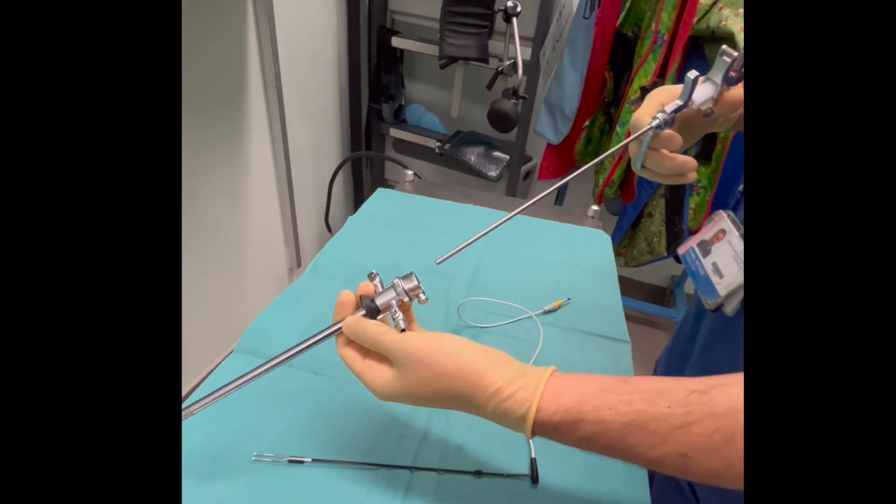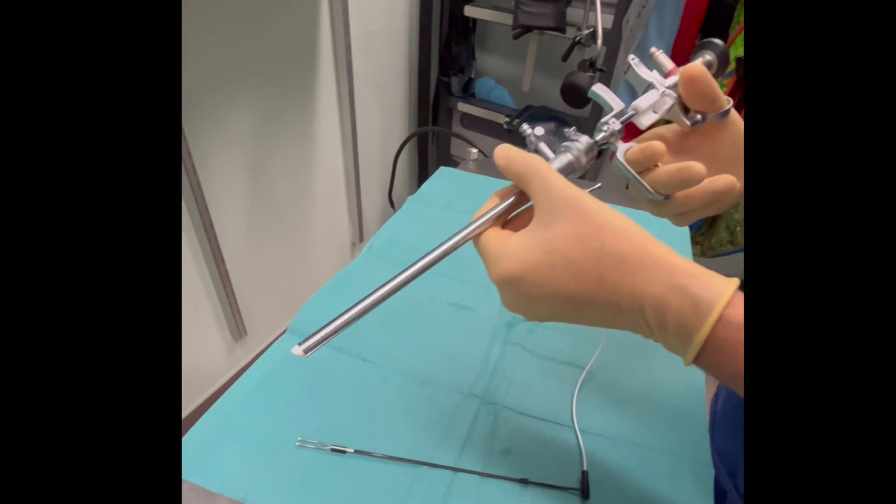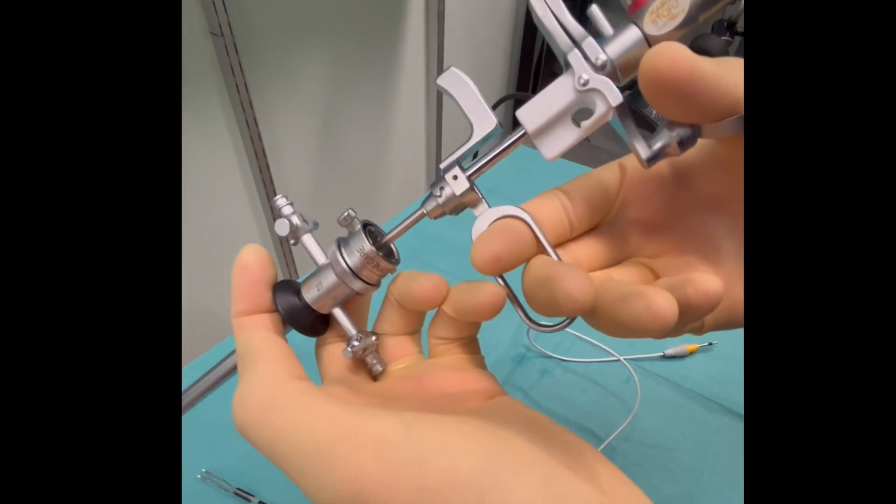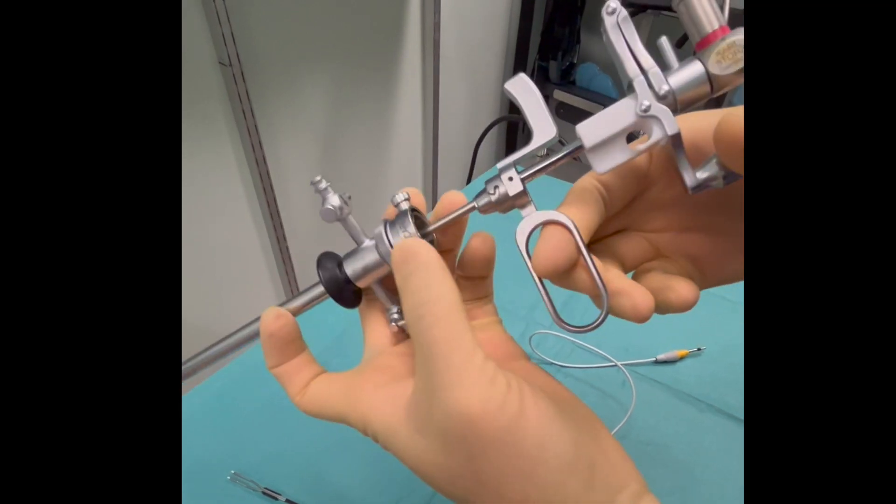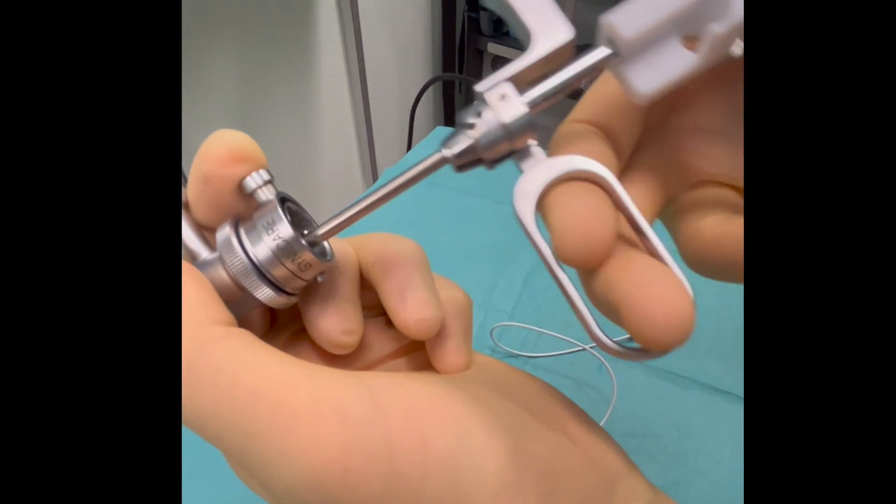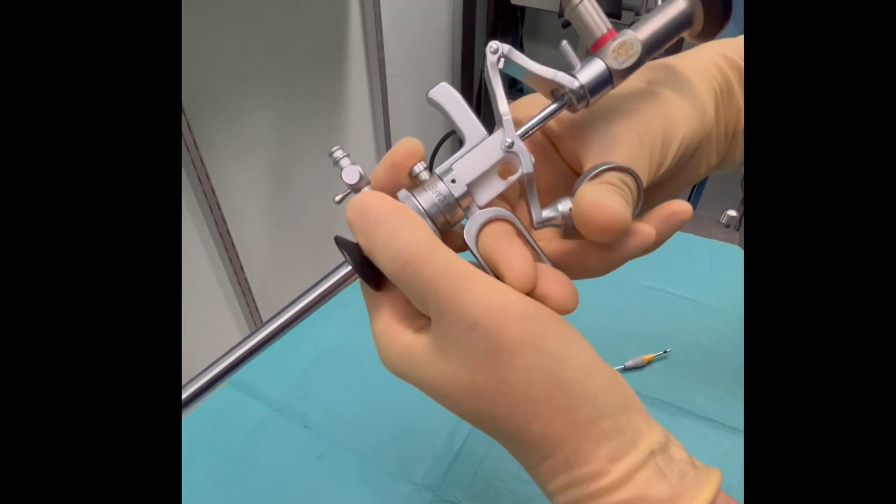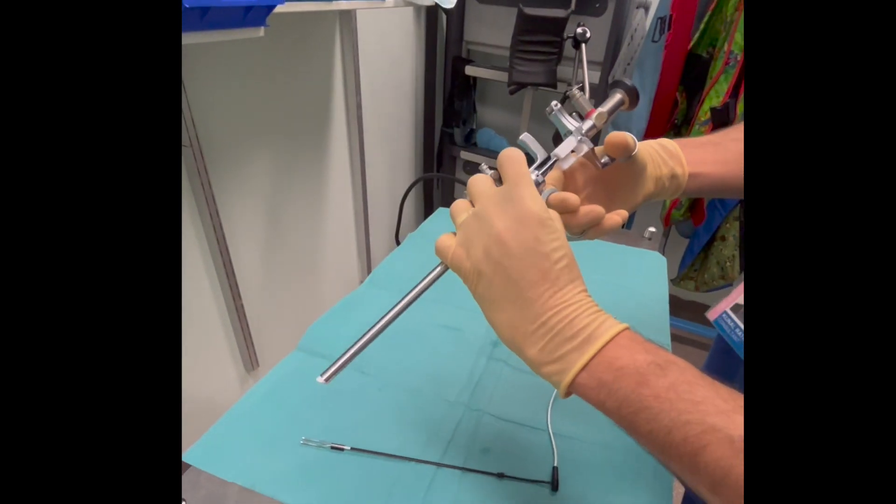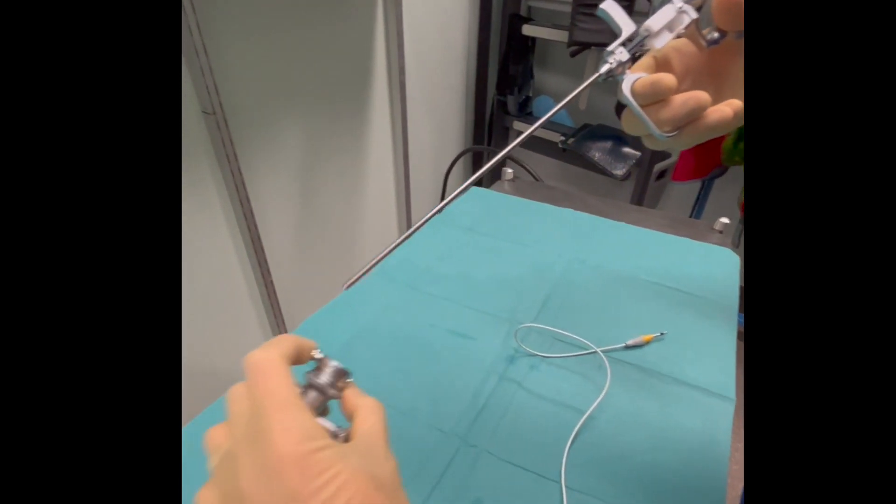Following which, the entire telescope is inserted into the flute channel. There is a simple button; on pressing it, it gets locked. We confirm that the system is correctly locked without any loose attachments to prevent any water leakage during the procedure.